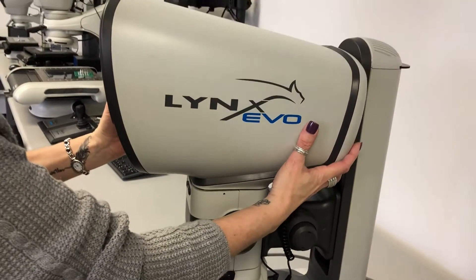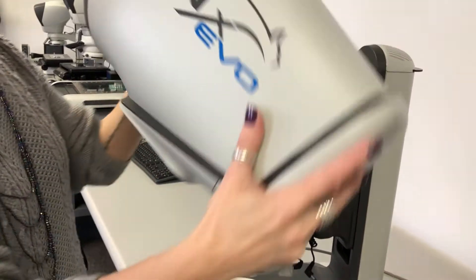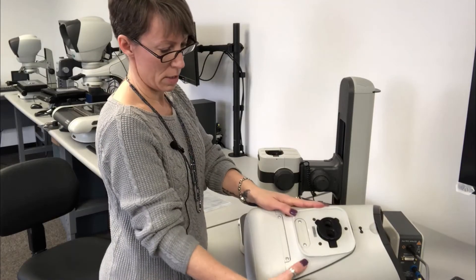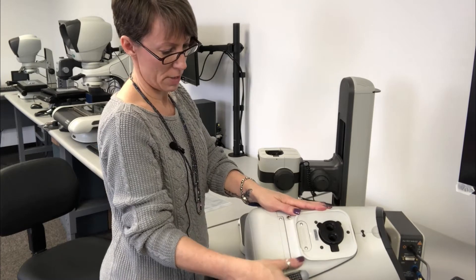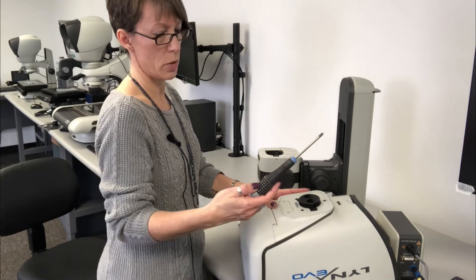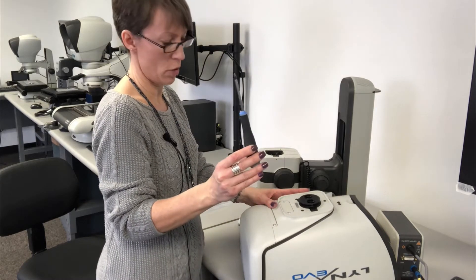Using two hands, carefully remove the head and put it upside down on your workstation. The desiccant is located under this plastic cover. To remove the cover, you're going to want to use a number one pozi screwdriver.